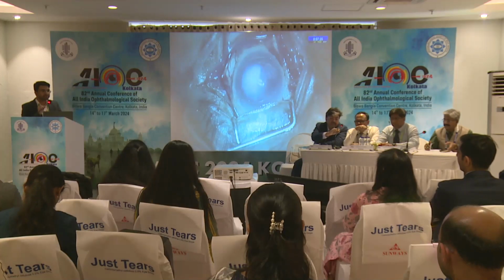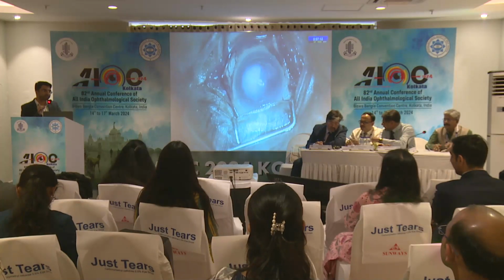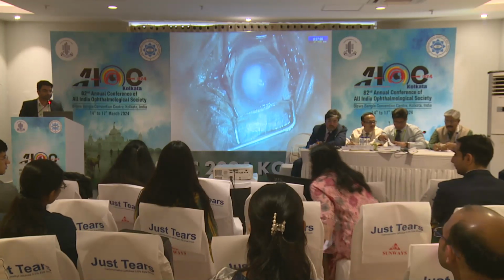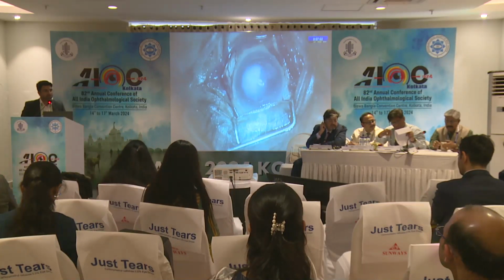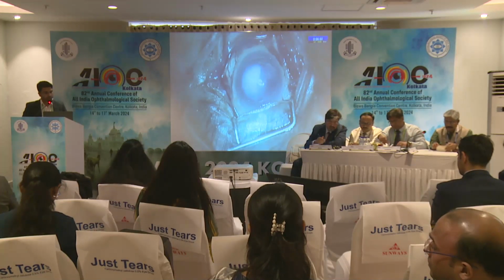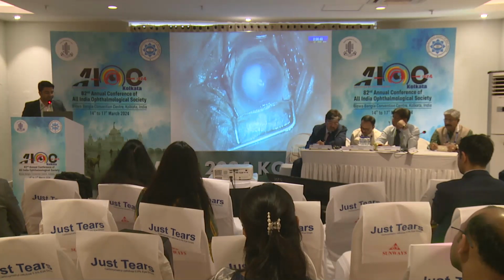I'll definitely. It's a 58-year-old female patient presented with post-traumatic corneal scar with left eye aphakia with dropped intraocular lens on posterior segment ultrasound scan. Even though this was a challenging and complicated case for us, it was a rewarding surgery for both the patient as well as the surgeon. So we decided to go with a simultaneous complex surgery, pars plana vitrectomy assisted with a temporary K-Pro along with glued IOL and IOL explant and an optical penetrating keratoplasty.